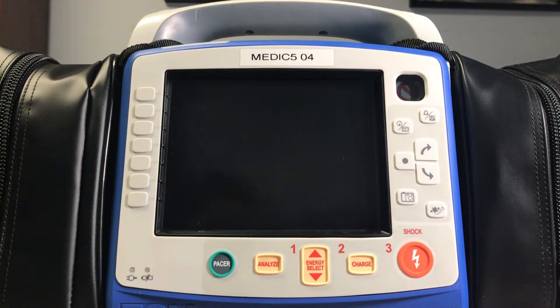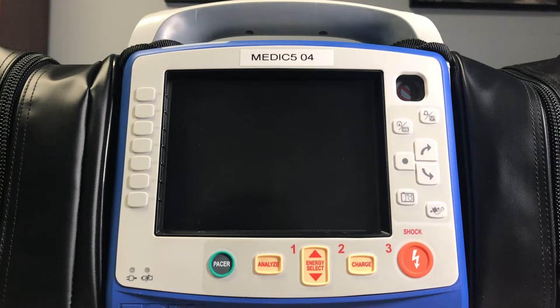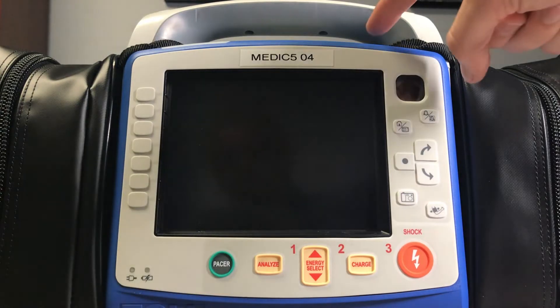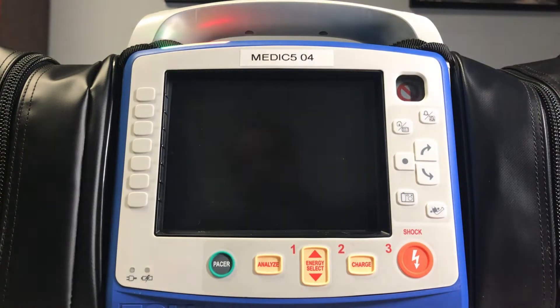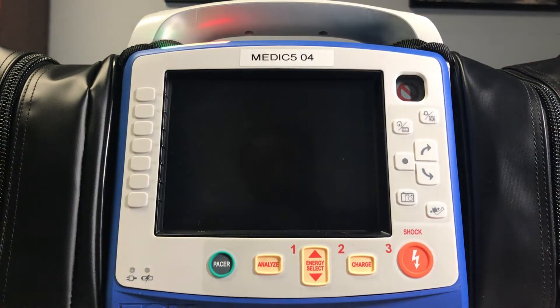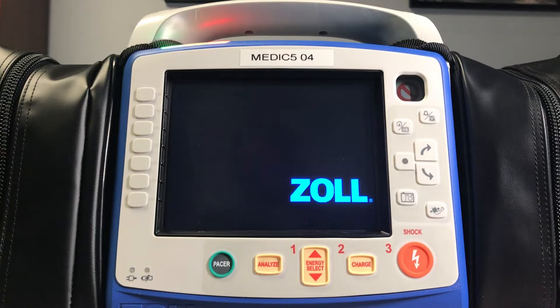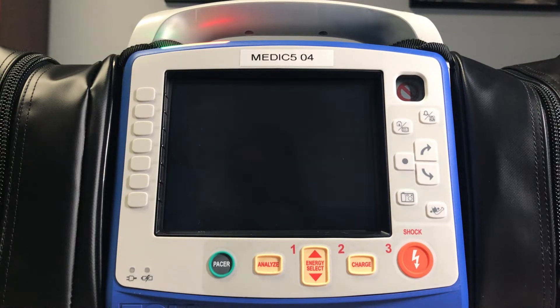Hello everyone and welcome to an instructional video meant to help you through uploading your vitals trends to EMS charts from the Zoll Monitor. First, power on the Zoll Monitor. The process will be the same whether you've just finished the case or whether you're starting it up afterwards.